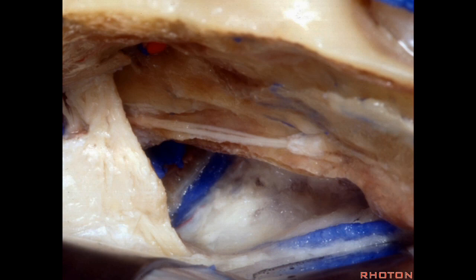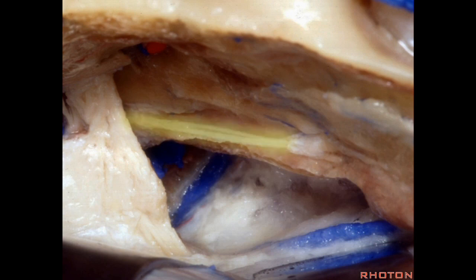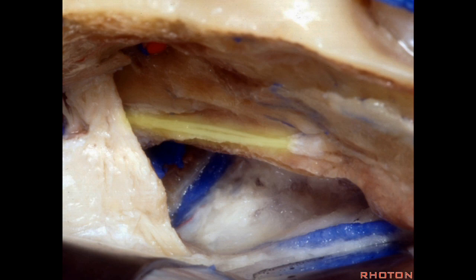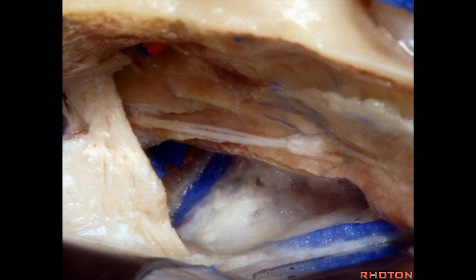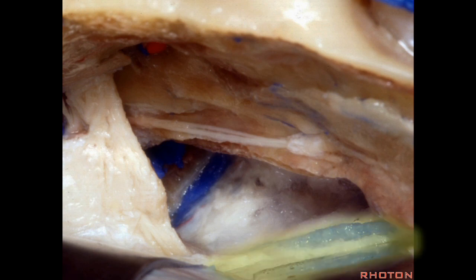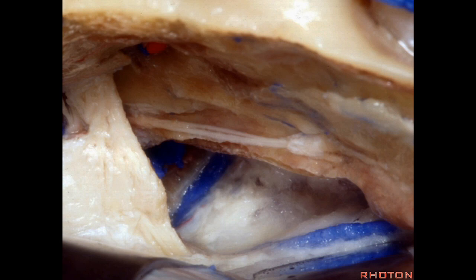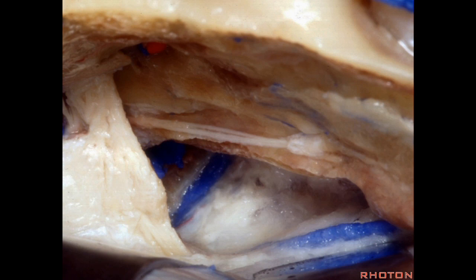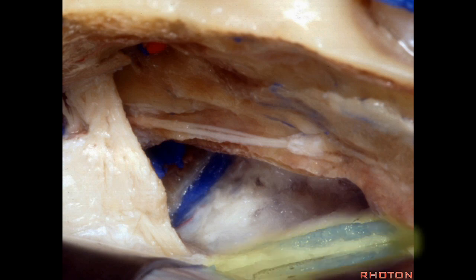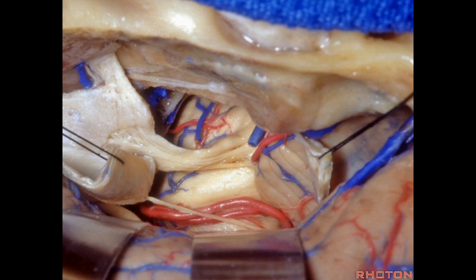For the anterior petrosectomy approach, we drill medially to the porous, behind the greater petrosal nerve. The carotid — if you drill this bone — you'll find it just under the greater petrosal nerve. You drill under the superior petrosal sinus, down under the third trigeminal division, to the side of the clivus, along the inferior petrosal sinus. Then you open the temporal dura and divide the superior petrosal sinus, then divide the tentorium.